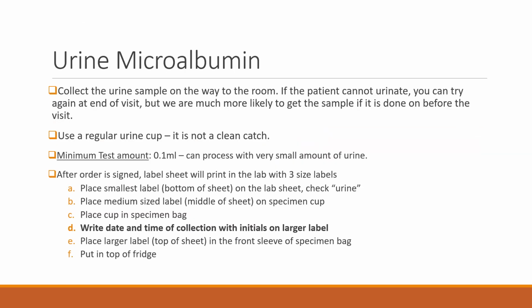Then the urine microalbumin, when you order it, it will generate a label that will be printed in the lab. You can use a regular urine cup to collect it. It's not a clean catch, and you really don't need a lot of urine to run this test at all.